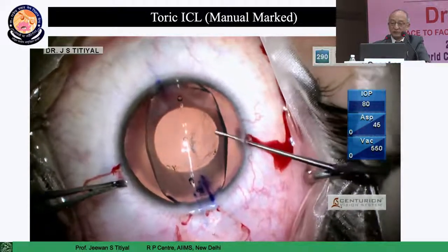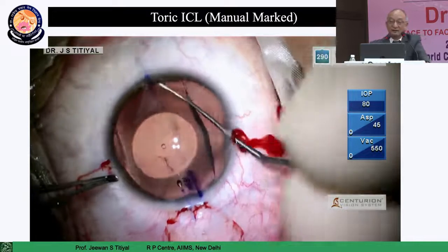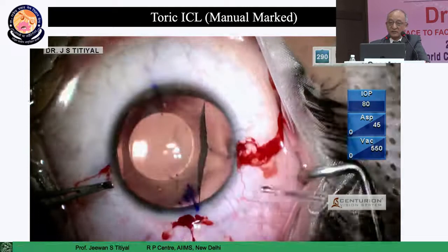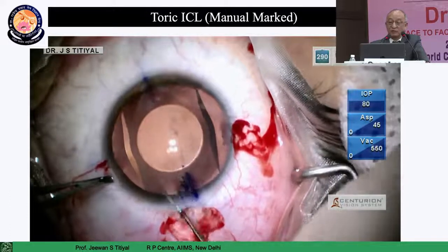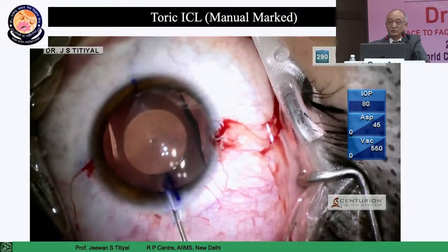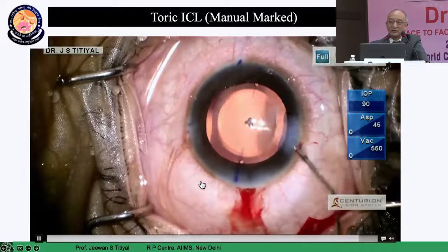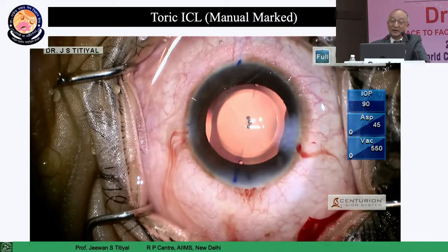The viscoelastic material used should be of good quality — gives clarity, causes no inflammation, comes out as a bolus, and there is very little chance of retained viscoelastic, so glaucoma risk is minimal. Disengage and engage the haptics behind the iris plane, then rotate the lens before you take out the viscoelastic — that is very important. You cannot rotate the lens after removing the viscoelastic. After placing the lens on the correct axis, hydrate the wound and do a bimanual aspiration for very controlled removal of viscoelastic. The central port also helps remove viscoelastic from behind the ICL.